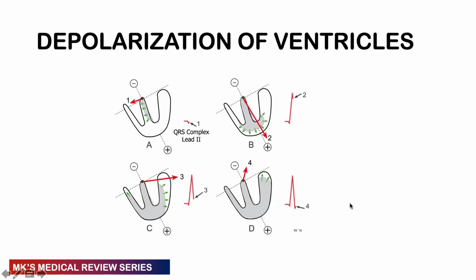So remember that when the depolarization is happening, you have the AV node being depolarized there. There'll be a current that first spreads on the left side here, so it will depolarize the left bundle branch. So if you have a lead here on the opposite side and a lead here on the opposite side, remember that our initial cardiac vector is moving in that direction, but the left side is going to depolarize first. So it means that this lead here on the left side is going to be showing you that there is predominantly a wave, because this is going to be depolarizing going in that direction.